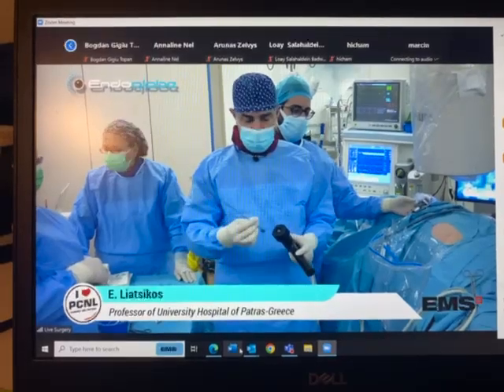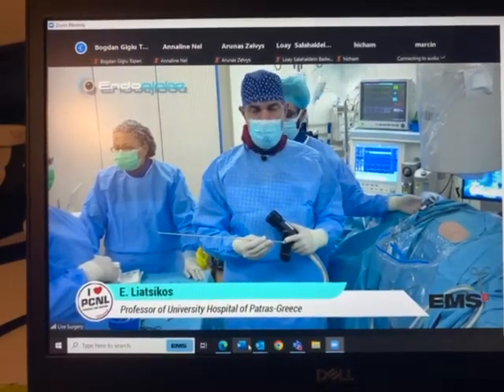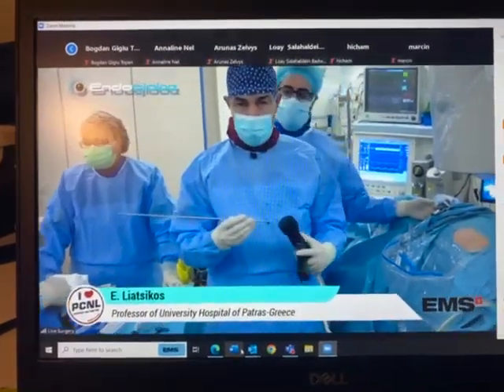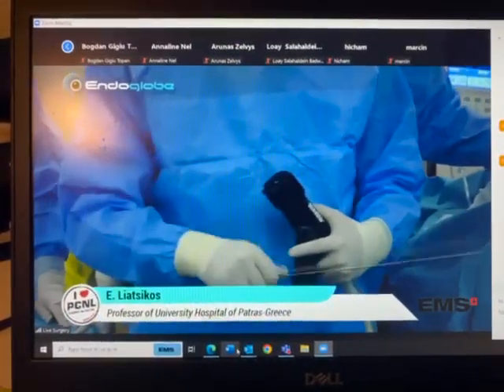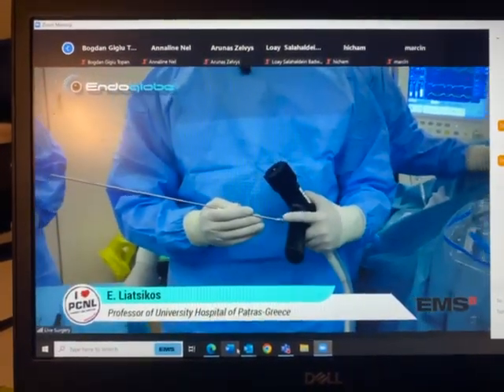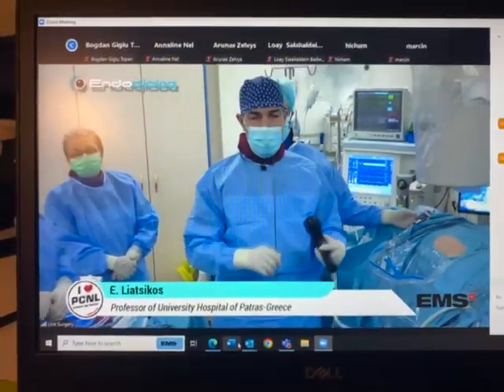It's very easy to assemble. The probe we're using here is the 3.9. It is coated blue, so it has a blue plastic part on it. It's very easy for you to identify and for your nurses to identify. The smaller probe that would go through the slender scope, and you will see Panagiotis using it later on, is a green label, the 3.3. So depending on the diameter of the scope, you reduce the diameter of your probe.